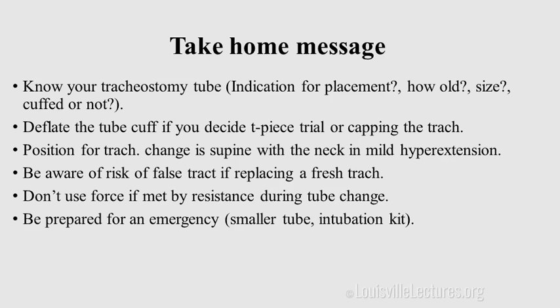Always be prepared for emergency — have a smaller size tube, an intubation kit, and a respiratory therapist with you. Any dealing with airway, whether during intubation or trach management, you have to be prepared. Because if you lose the airway, desaturation and emergency can happen fast, and you will not have time to go look for an intubation kit. This can be life-threatening.